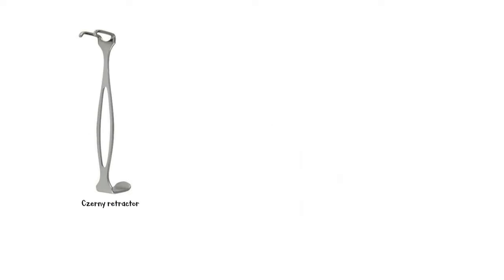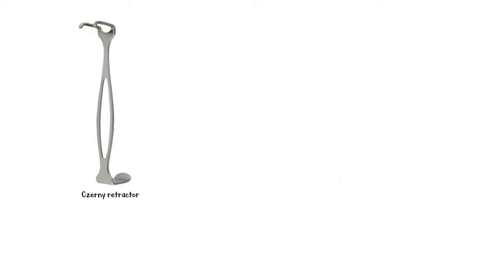Then we have the Czerny retractor, one of the most commonly used instruments in general surgery, including hernia repair and laparotomy.